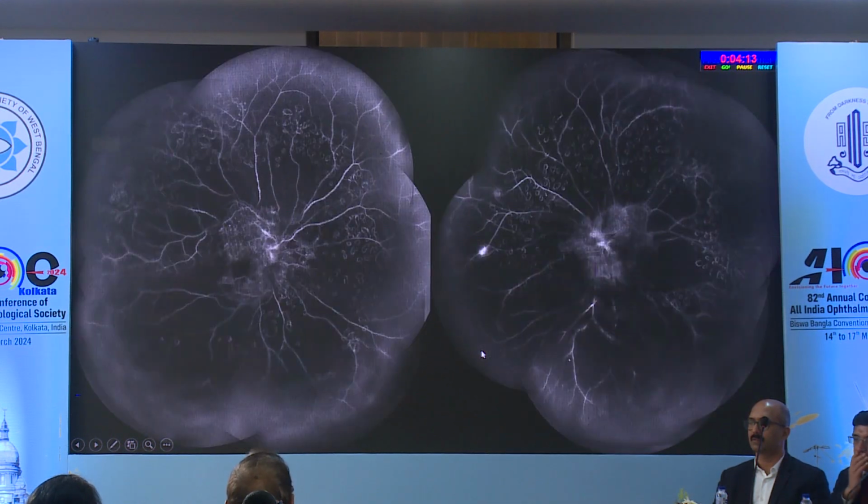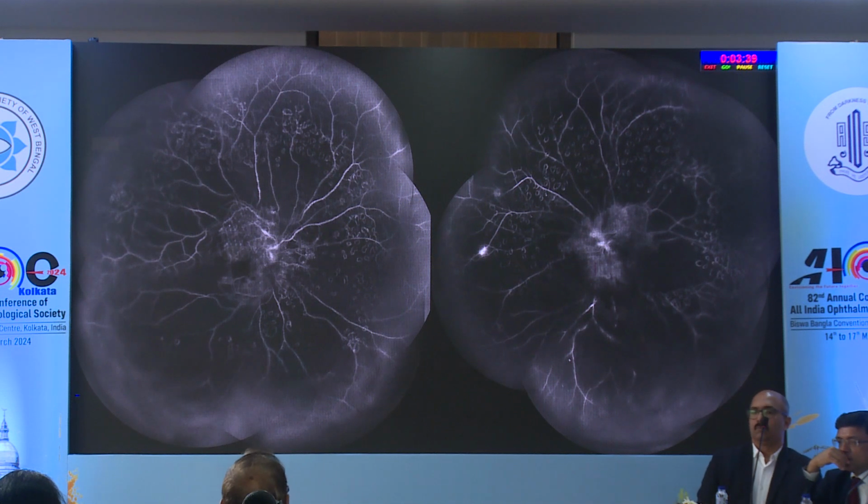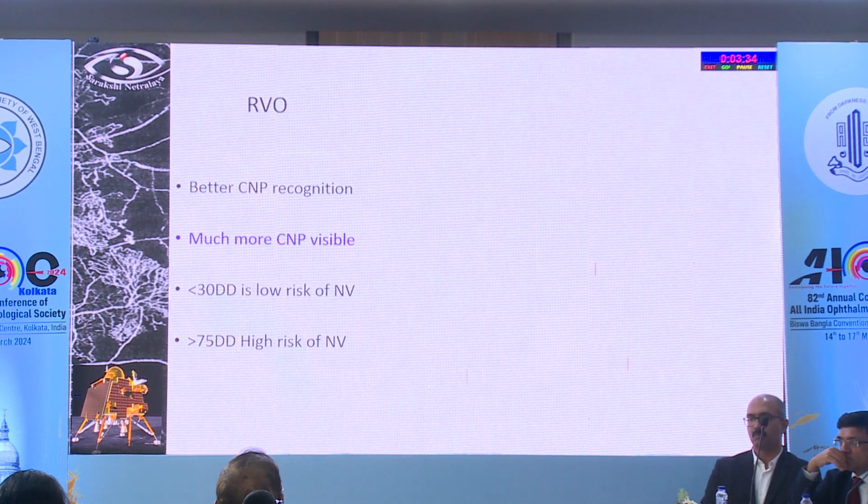And a Widefield angiogram could show you that the dropout area was not necessarily only restricted to the posterior to the equator. The standard teaching is that proliferative diabetic retinopathy is a posterior pole disease. So that means we used to do pan-retinal photocoagulation only up to the equator. While this challenges our basic understanding of this disease, yes, the dropouts can extend even anterior to the equator, and so is the need of extending your pan-retinal photocoagulation right from the arcade up to the ora serrata, at least in cases where there is recurrent bleed or in a case of a recurrent diabetic macular edema.